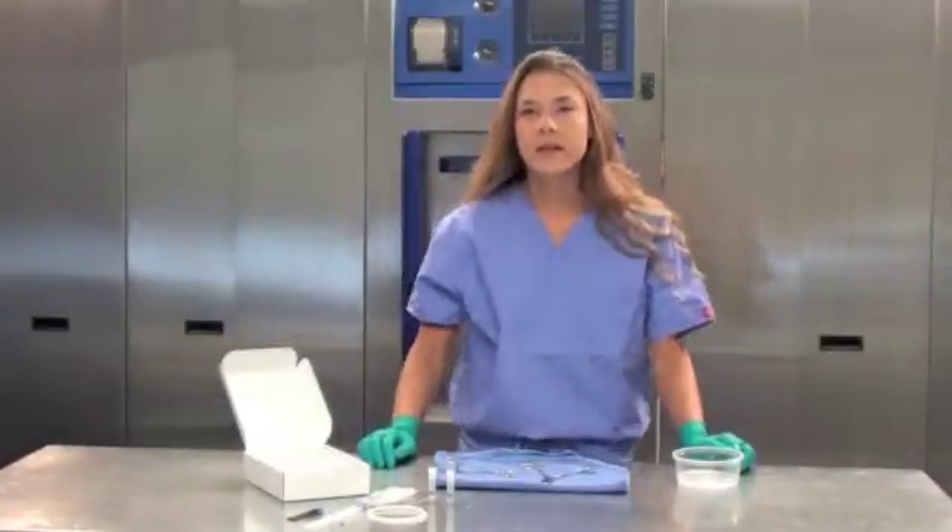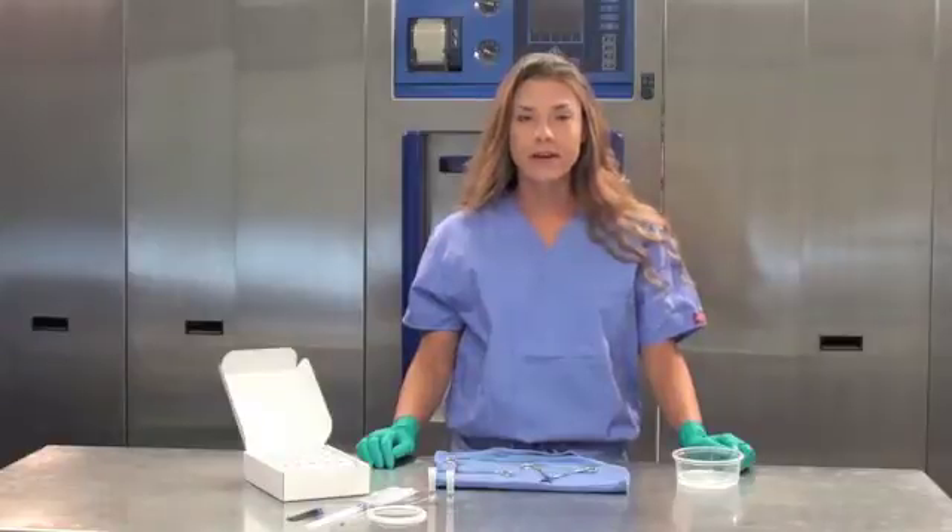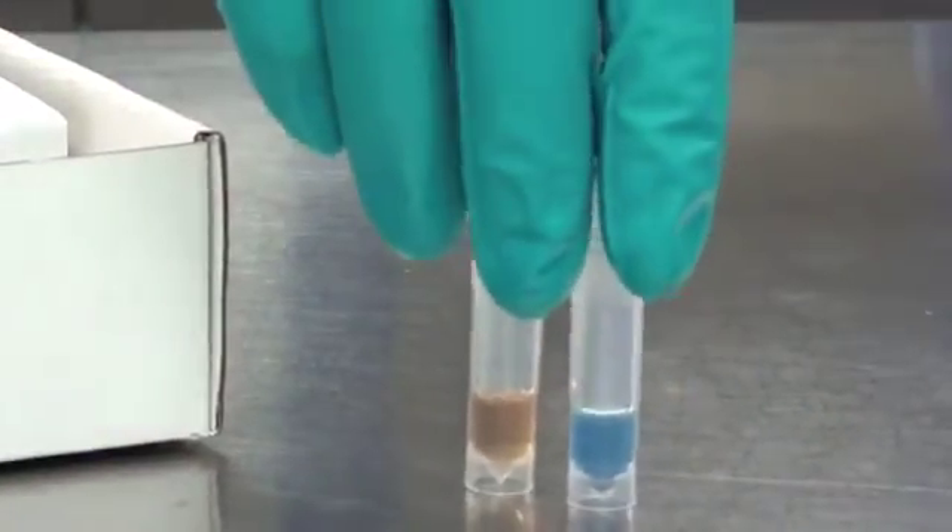Hi, I'm Christy Singleton and I'm the Research and Development Manager for Steratech Products in Englewood, Colorado. Today I'd like to introduce you to the WashChex Pro.